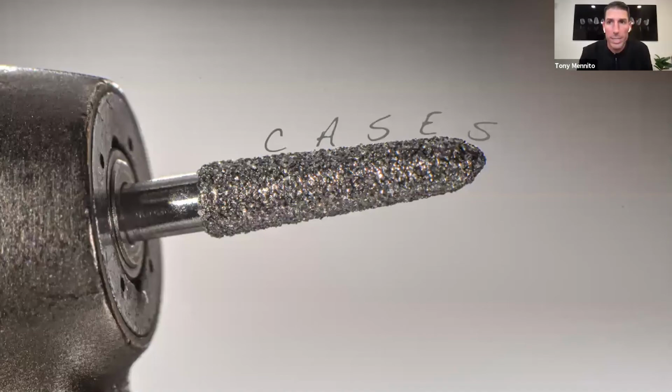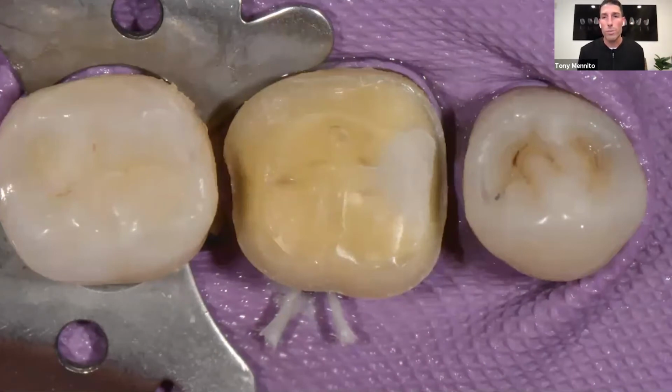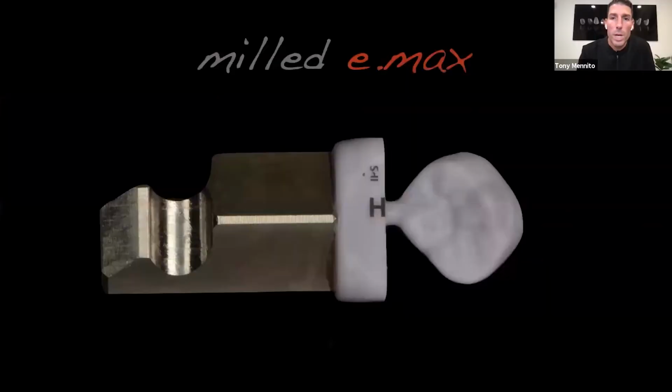Let's talk about a couple of different cases. And I'm going to start with, this is my crown prep. This is that tabletop crown prep where we're trying to keep a lot of the strength of the tooth by preserving the biorim. The biorim are basically the axial walls that you would normally cut away to get retention for a conventional crown prep.